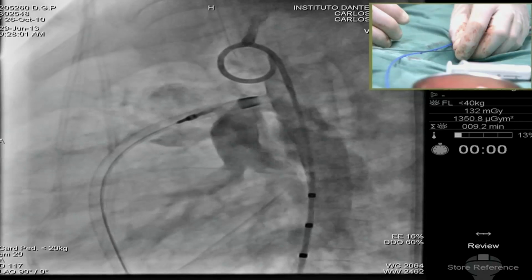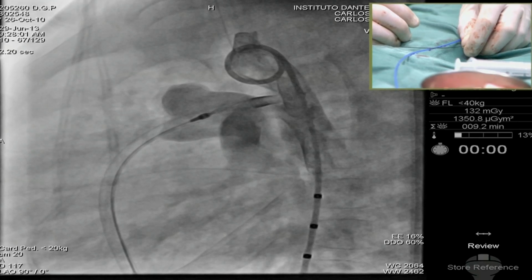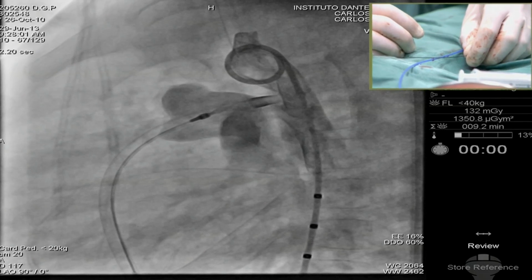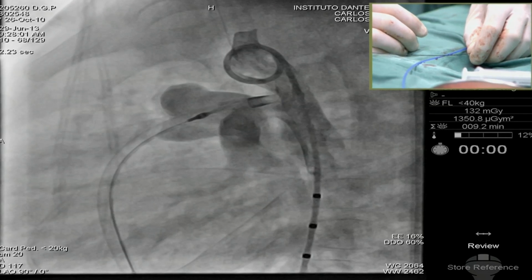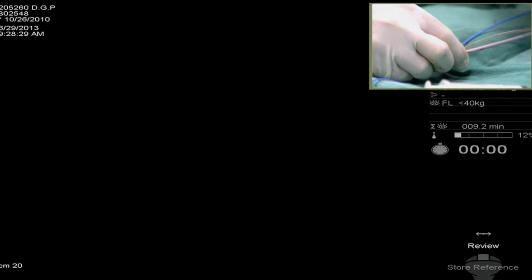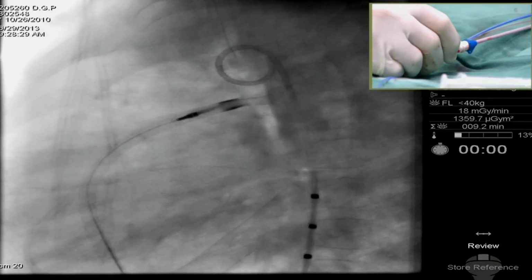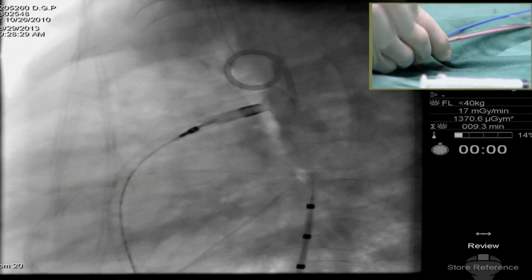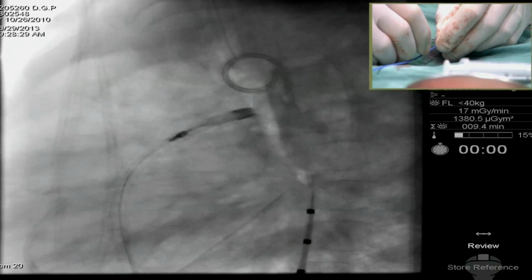That was exactly my point, that it is almost 50% of the circumference of the aorta. Franz, what were you going to say? Yes, if you can configure the device a little more and push again the aortic wall, the posterior, then maybe you get a better configuration of the device. Franz wants you to flatten the device. Yeah, only to try to do it. It's not flat at all, as it appears on the table outside the body. Is that right? Yeah. It's confined by the aortic wall. Yeah, really, lots of tension here.